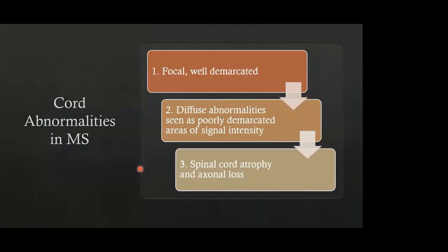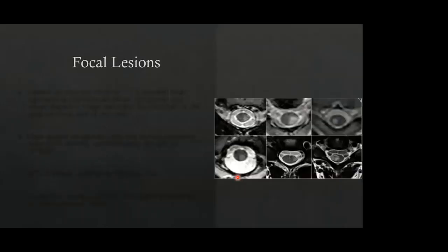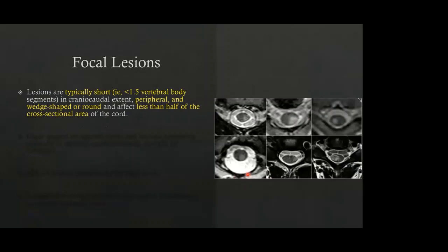In MS, there are three types of cord abnormalities. The focal well-demarcated lesions are the most commonly observed. There are also diffuse abnormalities seen as poorly demarcated areas of spinal cord abnormality. Third is the atrophic or axonal loss phase. The focal lesions are typically short segment — less than 1.5 vertebral body segments in craniocaudal length — and peripherally located, either wedge-shaped, rounded, or triangular, spanning less than half of the cross-sectional area of the cord.